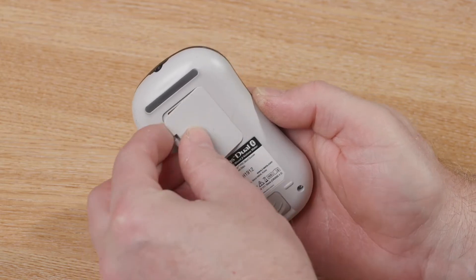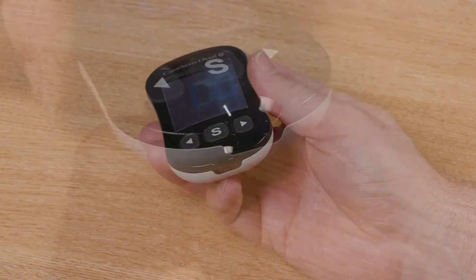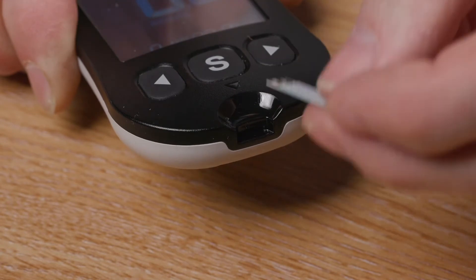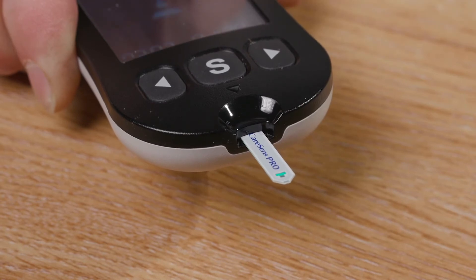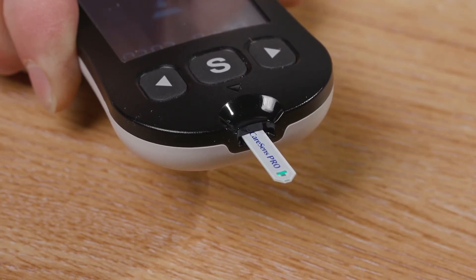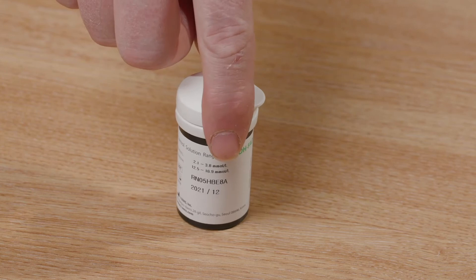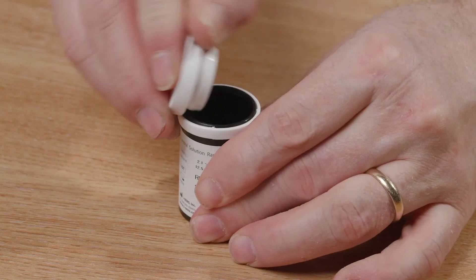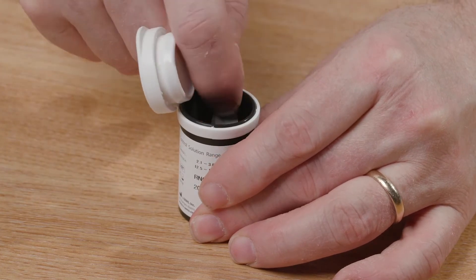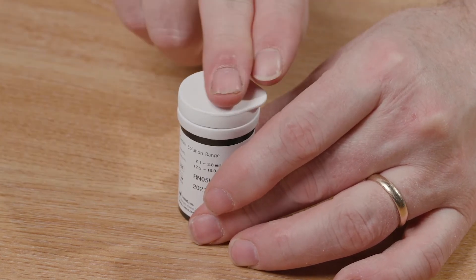Please turn the meter to the front. At the bottom of the meter you will see a small space where the blood glucose test strip is inserted. When the test strip is inserted, this automatically turns the meter on. Set the meter to one side and pick up the tub of glucose test strips. You will see that the glucose test strips have a use by date on the side of the tub. If they are out of date, please do not use them. Take out the test strip and close the tub securely. Test strips are stored in the tub as moisture in the air can affect your accuracy. Always close the lid after you have removed the test strip.